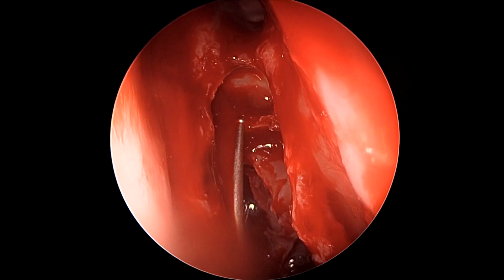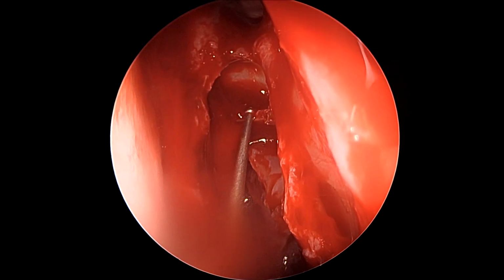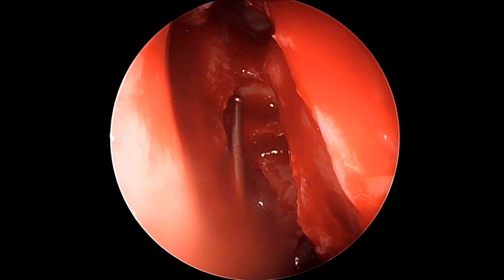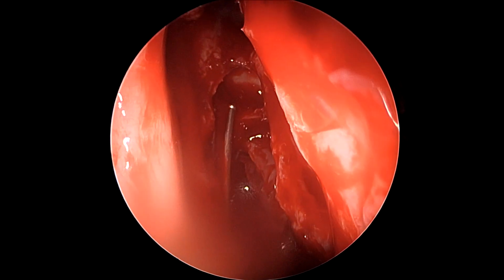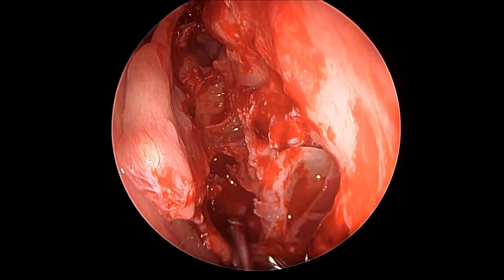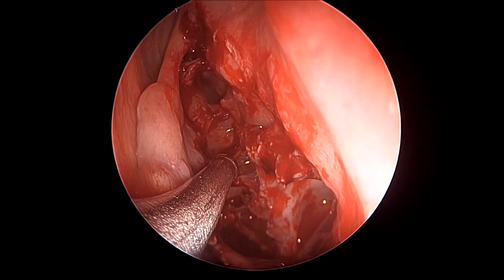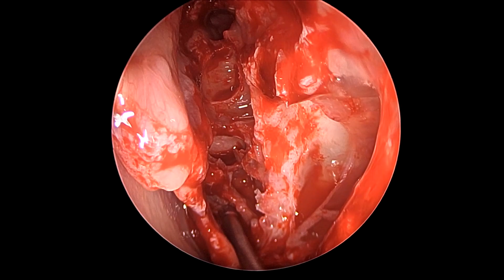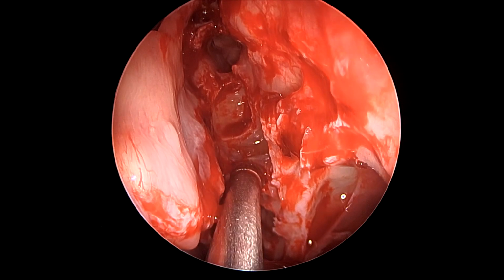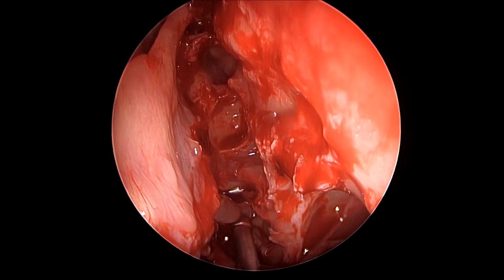So here we see we're using our navigator probe to point towards the fovea ethmoidalis, the minimal amount of septation left, which is quite safe to be left behind, and this shows us how to complete the ethmoidectomy with a clear frontal sinus visible in front of us. The maxillary sinus, now we use an angled 70-degree telescope pointing upwards to again have an orientation of the entire ethmoidectomy cavity as seen from below. This angled telescope is an acquired taste, so to say, and hugely helpful in managing these lesions, hugely helpful in managing CSF leaks, and it requires us to become familiar with the vision from there.